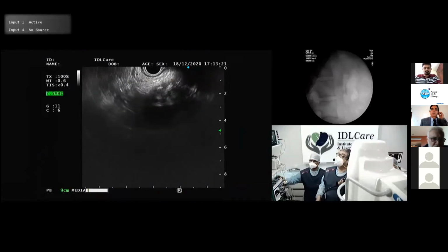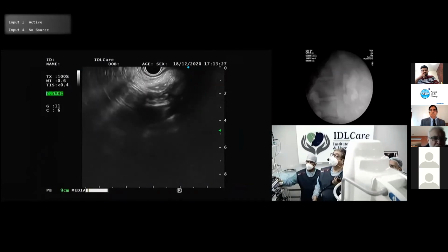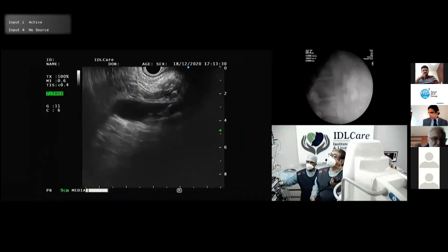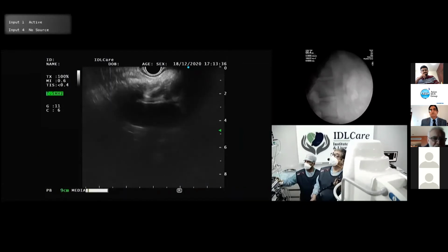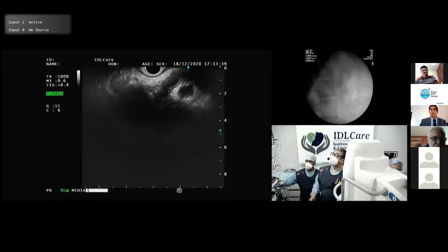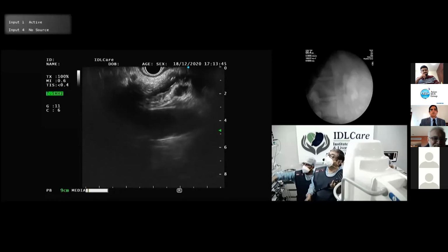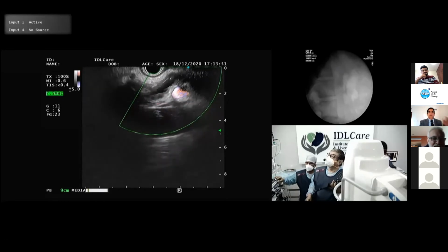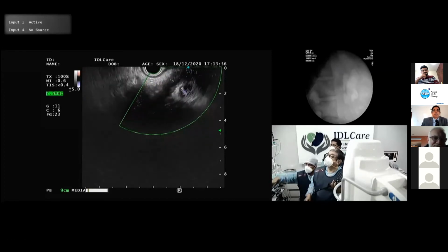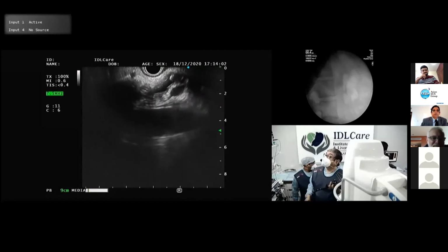I think I'm seeing the pancreas. This is the pancreatic duct. Dilated. I keep withdrawing till I get a good Doppler. I think this looks like a nicely dilated duct. See that? Can you see the duct? Yeah. It is very thick walled, extremely thick walled duct. Leave it, switch off the Doppler. But I will not puncture till she stops hiccuping, because there are vessels around.